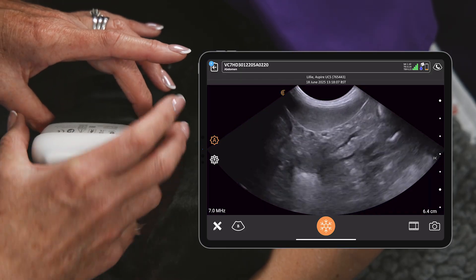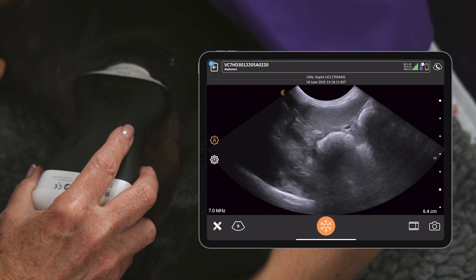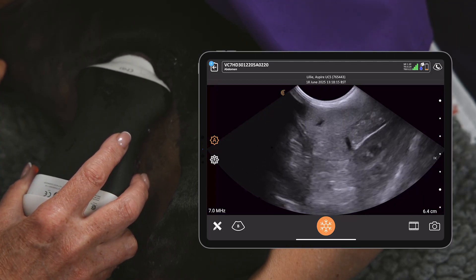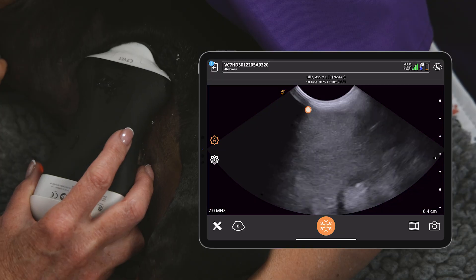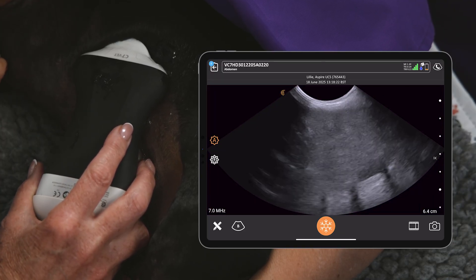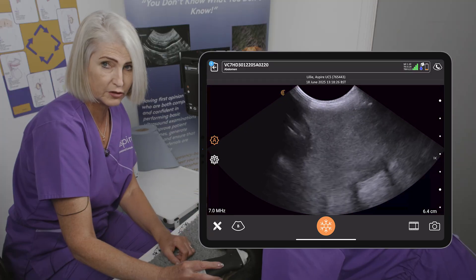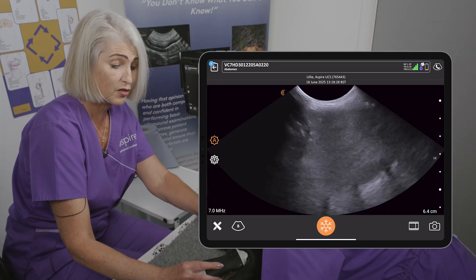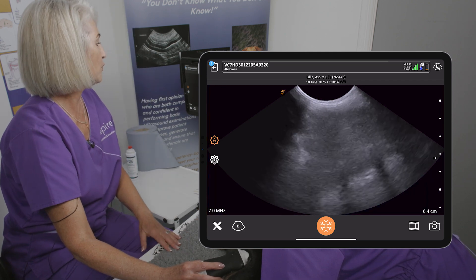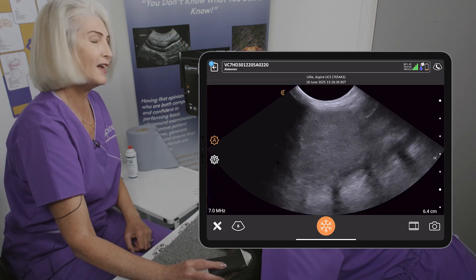As I start to get up towards the costal margin, this is where I might need to change the grip of my probe and angle right up under. Keep going — keep going until you think you can't go any further, but you can — and look at all this spleen under here, horizontal under that rib cage. If you can't visualize it all that way, you could in theory extend and scan intercostally.